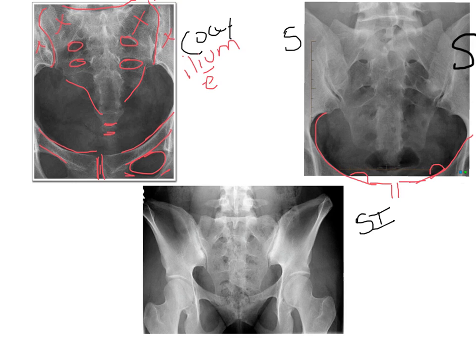Is one higher than the other, lower than the other? Are they equidistant from the sacrum? The sacrum should fill this entire pelvic brim area. So how do we know that we've angled correctly? We've got the correct amount of angulation and we've angled the right way cephalically. Well, we look at these sacral foramina.